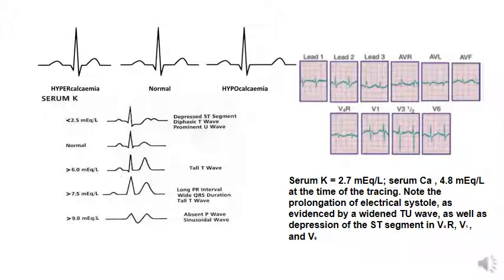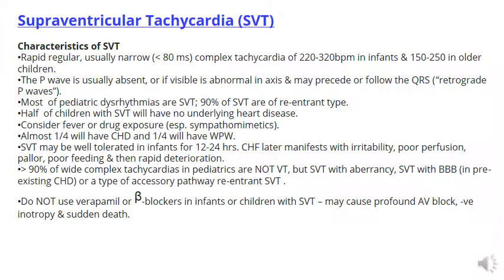Hypokalemia and hyperkalemia antagonize, I mean are reciprocal to, hypercalcemia and hypocalcemia. Now we come to important subjects. You see now and then in the pediatric age group, at any age, infancy or older children and so on.